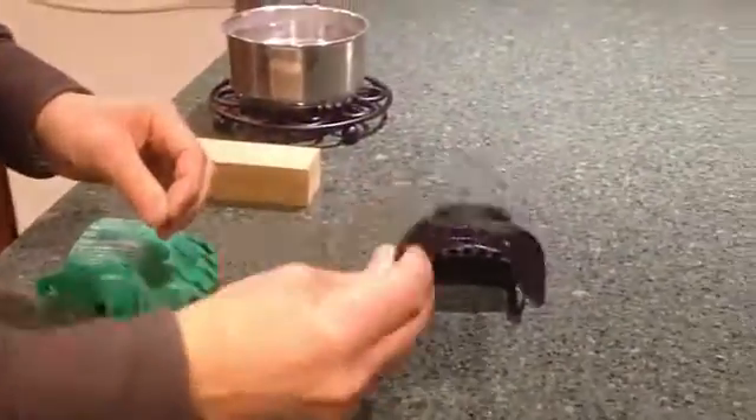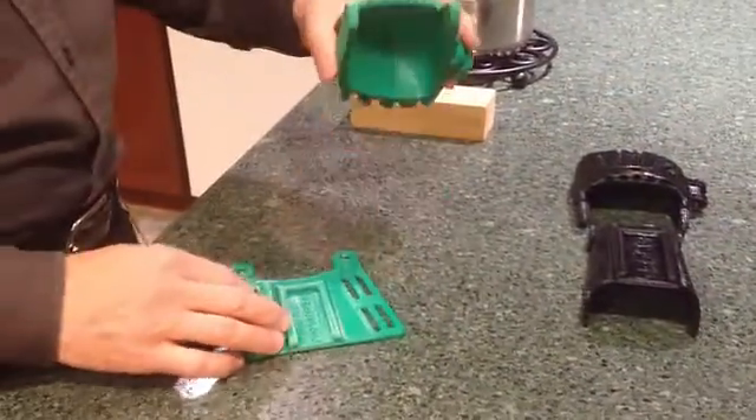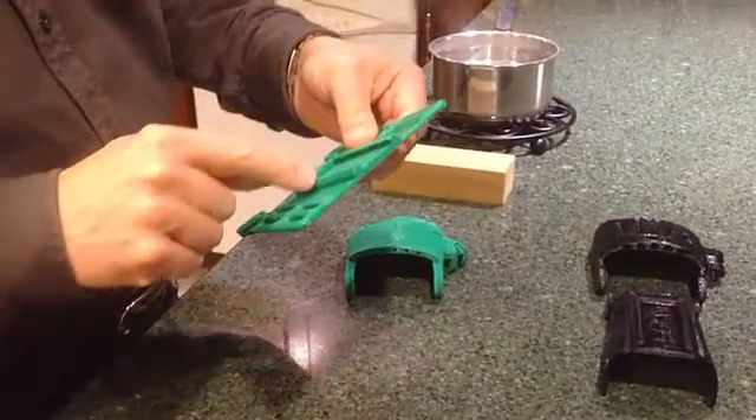This is the goal: we're going to turn one of these flat prints into one of these shaped gauntlets, and we're going to make sure that it fits accurately with the palm. This is the palm that this gauntlet was designed to fit.